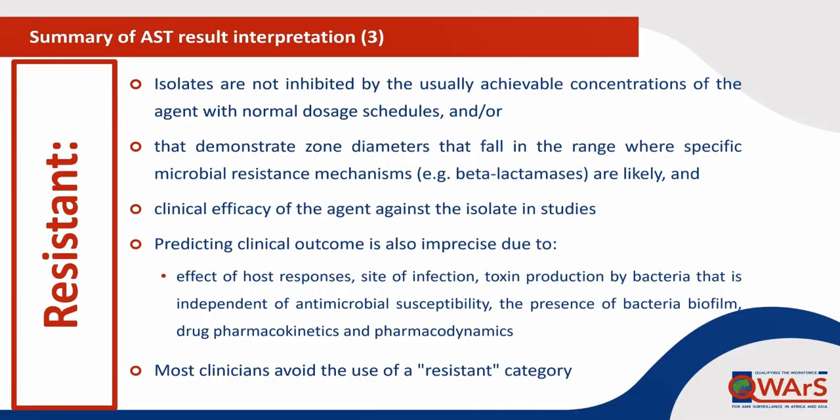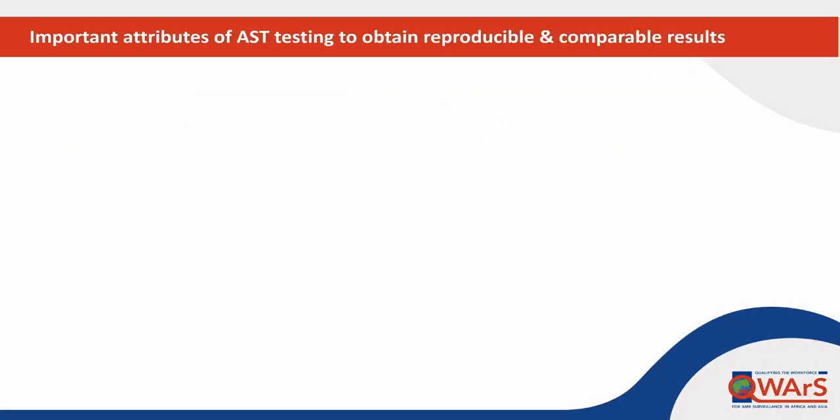This is necessary because numerical antimicrobial test results reported qualitatively, for instance, as susceptible, intermediate, or resistant, may hide an emerging resistance character in microorganisms with a small decrease in susceptibility that may still be classified as susceptible.